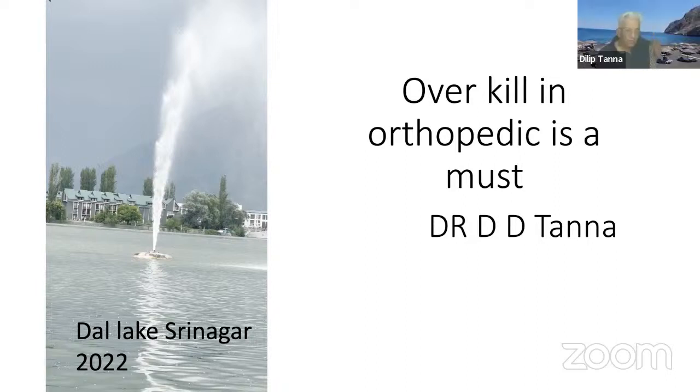And about reamers, my observation is that I'm working in four, five star hospitals. When we ask to change a reamer after 20 years of use, they say, sir, the reamer is working fine. Even some orthopedic surgeons tell me that. I think a reamer used for 20 years is never sharpened; hardly ever can we sharpen a reamer. There comes a time when you should use a sharp reamer, so you change to a newer one, particularly where cost is not the issue.